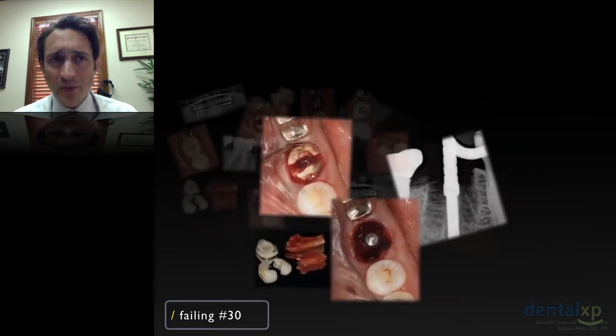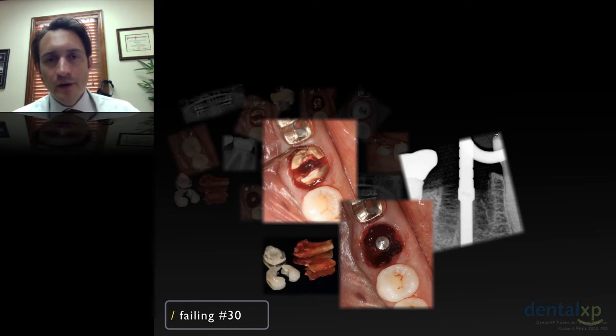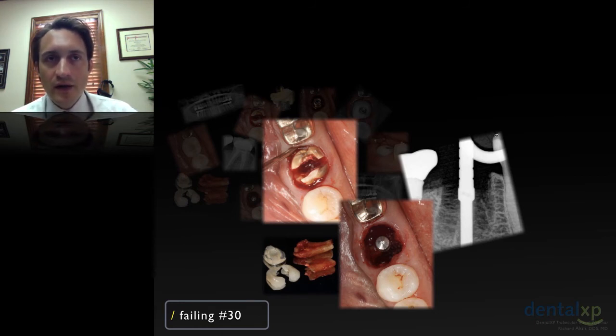So we'll apply our principles of minimally invasive flapless surgery. In this case, I always want to use a probe and radiographs and cone beam CTs if needed to determine as much information as I can prior to going in. If I tell a patient that there's going to be a 95% chance they're going to have a provisional and/or, in a molar region, an immediate implant, they like that. They come to me for that. My referrals expect that of me. They know that there are tremendous advantages to immediate implant placement.